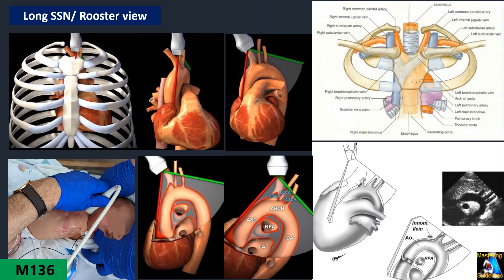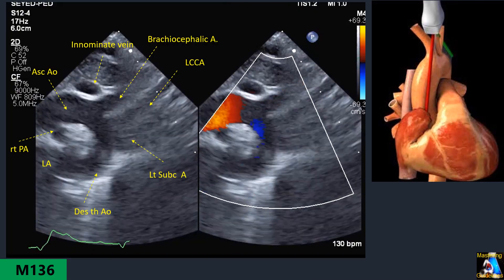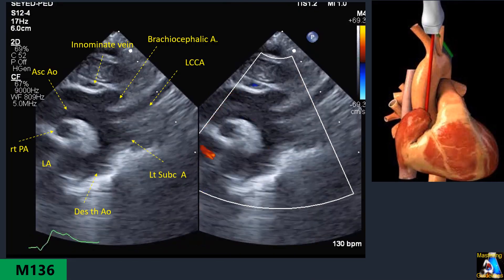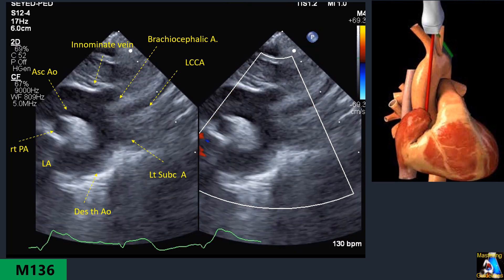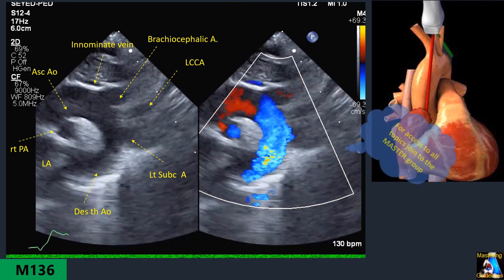We will cover detailed technique and the tips you need, especially for neonates, including all the details and maneuvers needed for the rooster view.